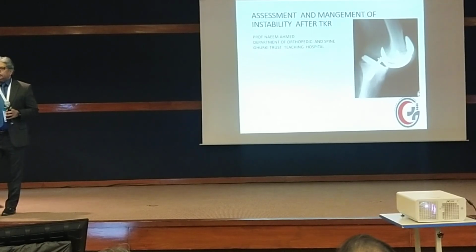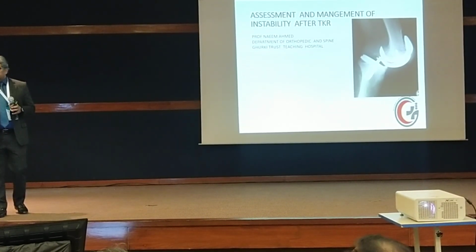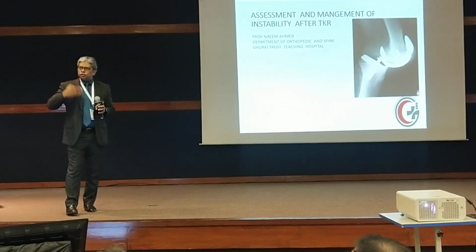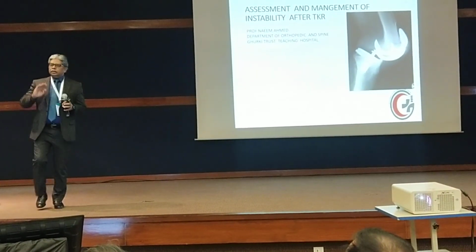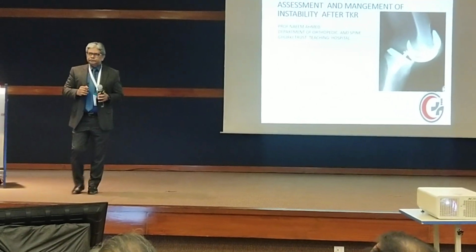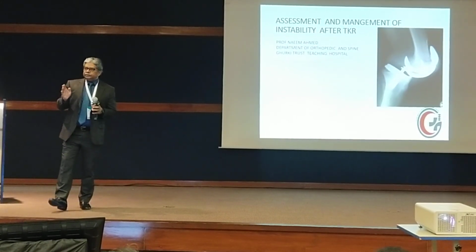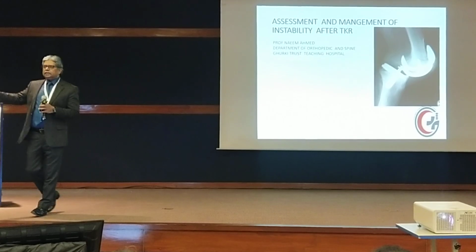A patella moves in the anterior surface of the femoral component and it remains in touch throughout the range of movement. Flexion शुरू करें और end तक जाए, patella should remain in touch. The medial facet of the patella should remain in touch with the femoral component. ये तो normal है. अब patella अगर out होता है तो किधर out होता है? Lateral. This is called lateral maltracking.